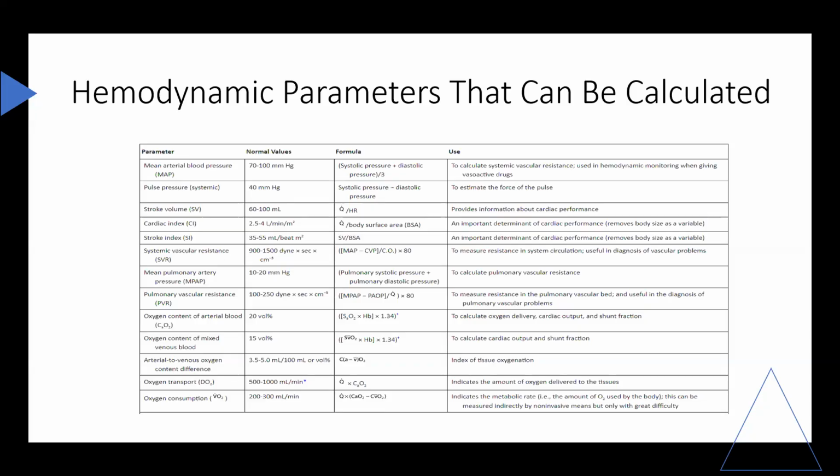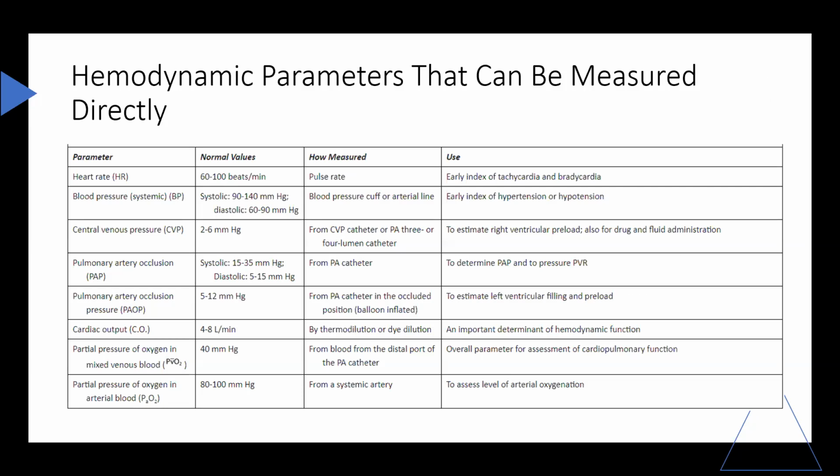In this table, you would see some of the hemodynamic parameters that can be calculated. And here our hemodynamic parameters can be measured directly.